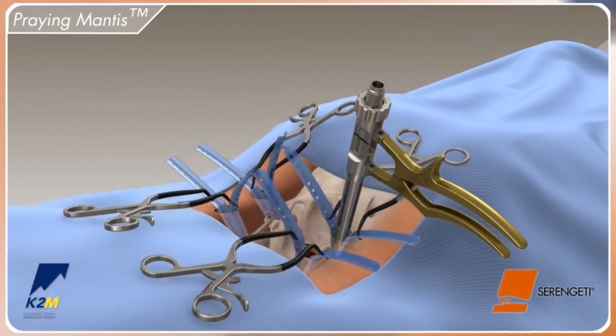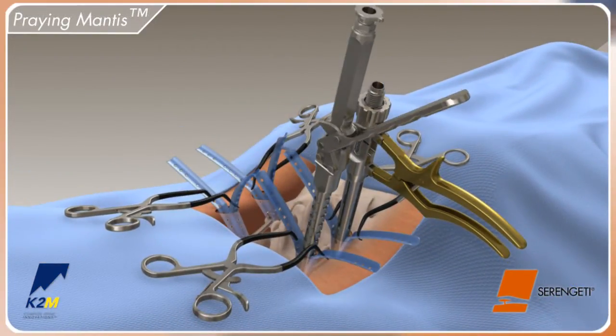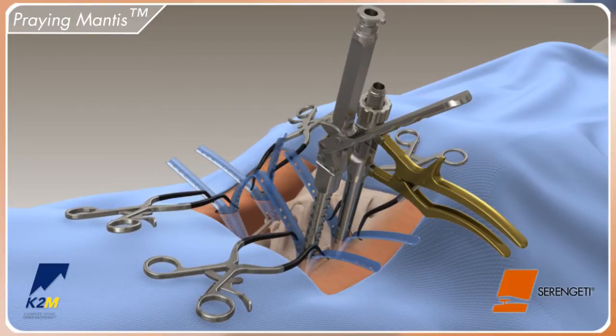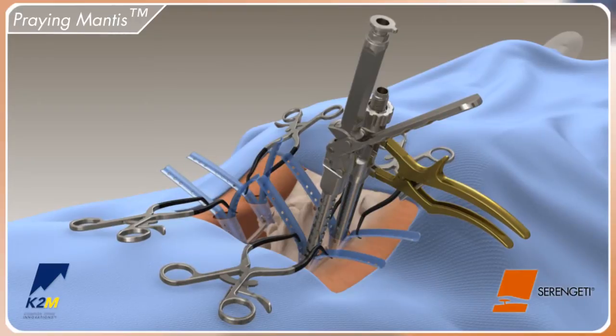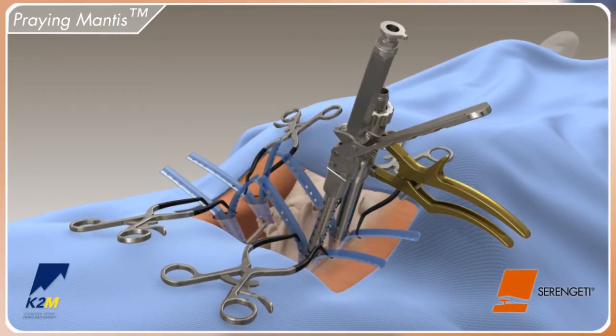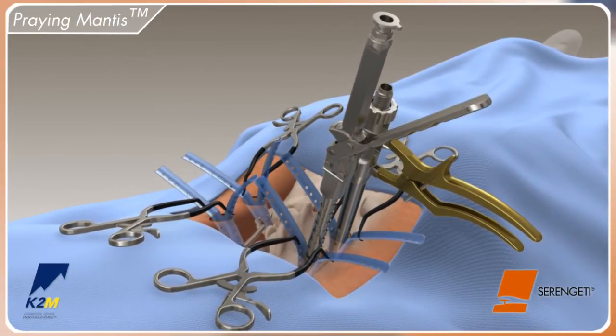The praying mantis may also be used as a reduction option. Position the instrument down the Serengeti retractor and apply a downward force to engage the instrument into the screw head. A medial lateral motion may be required to lock onto the screw head. Pull axially to confirm attachment and close the handle to reduce the rod.